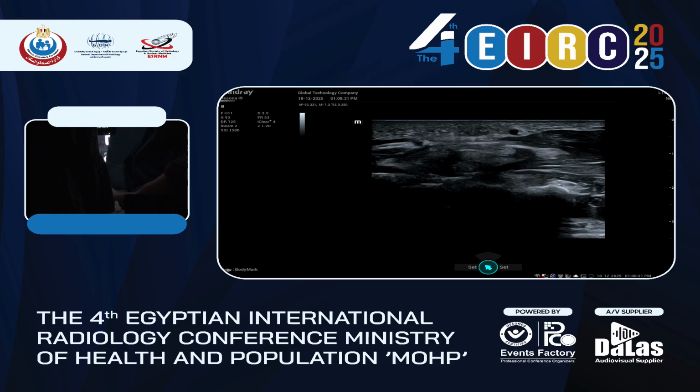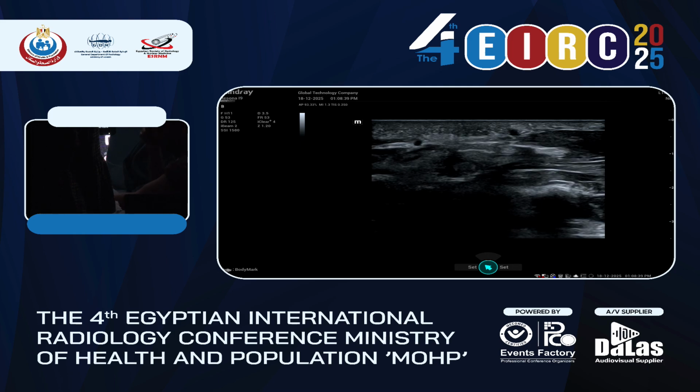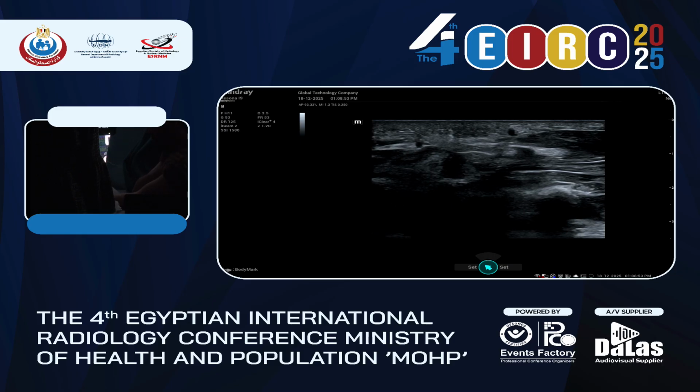Yes. So if this happens and the patient has pressure all along the carpal tunnel, even with the hypoechoic branches at the exit, it means that if they don't cut it all, we will end up with recurrent and persistent carpal tunnel syndrome. So we need to help the surgeon realize what type of operation they have to do. If they're not brave enough to do it, let somebody else do it for the sake of the patient.